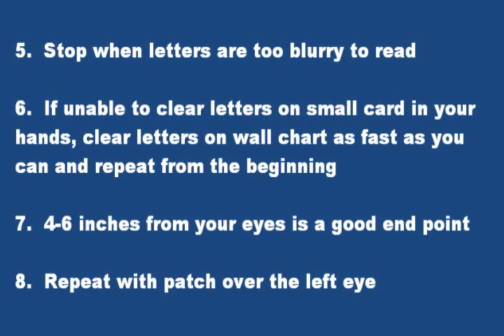6. If unable to clear the letters on the small card in your hands, clear letters on the wall chart as fast as you can and repeat from the beginning. 7. 4 to 6 inches from your eye is a good endpoint. 8. Repeat with a patch over the left eye.